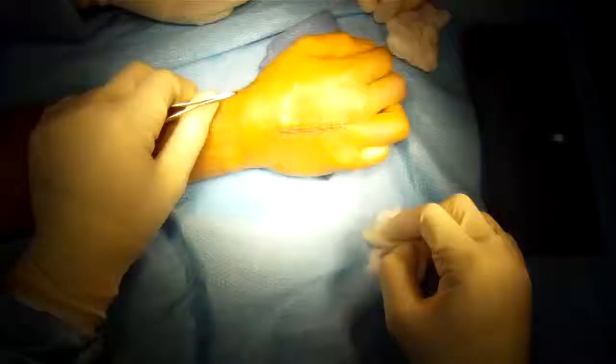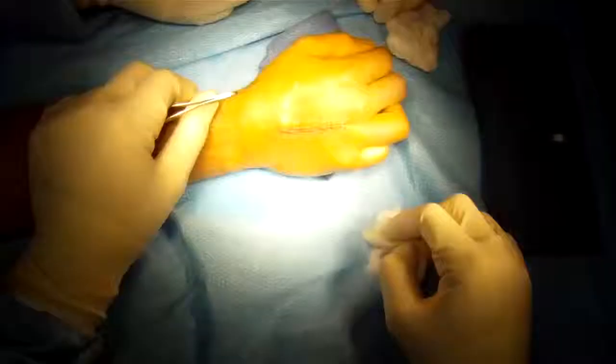Now we repair the tissues over the plate, suture up the wound. All done.